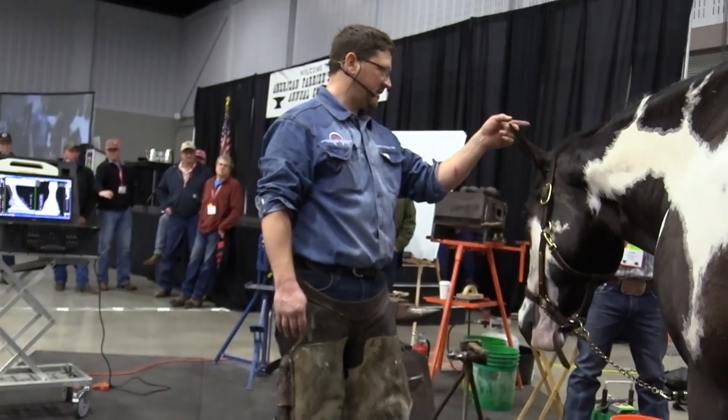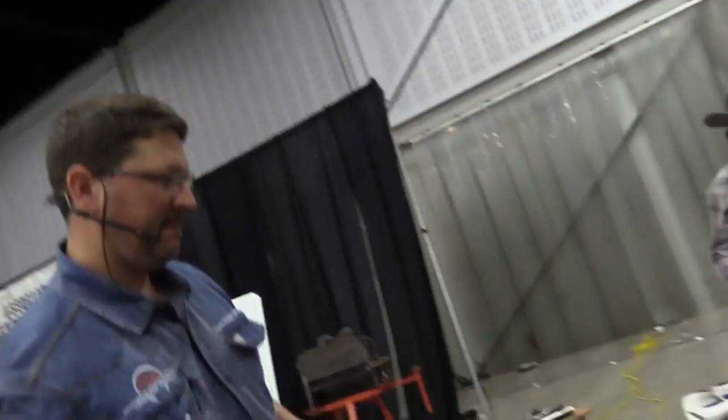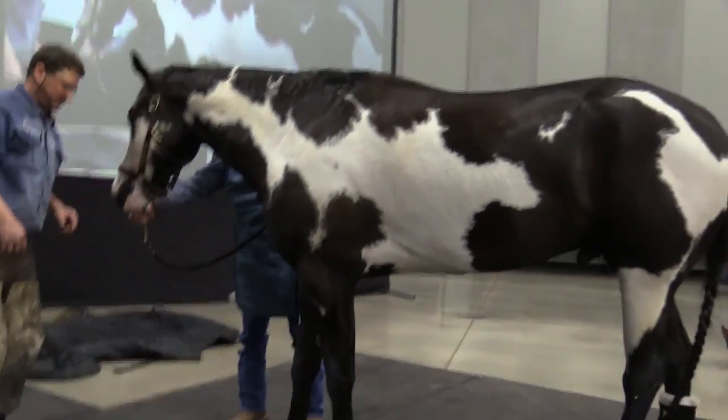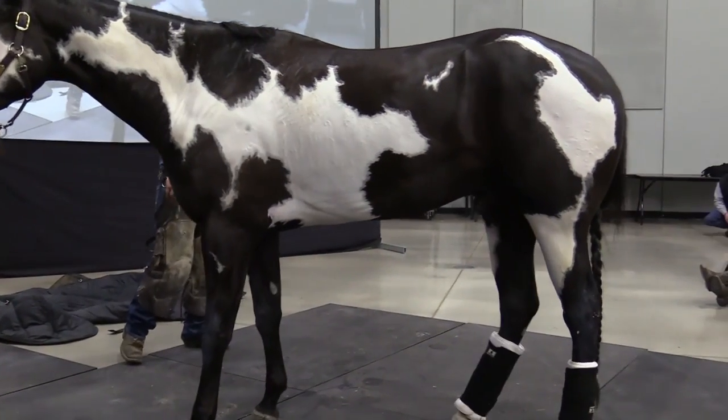So we need to face them. Let's just face it that way. That'd be easy to get radiation away from those folks. And we kind of shoot this one here. DVM it up. Let me make sure, let's scoot him forward a little bit. That way if he goes backwards, Lee, catch him if he goes backwards.